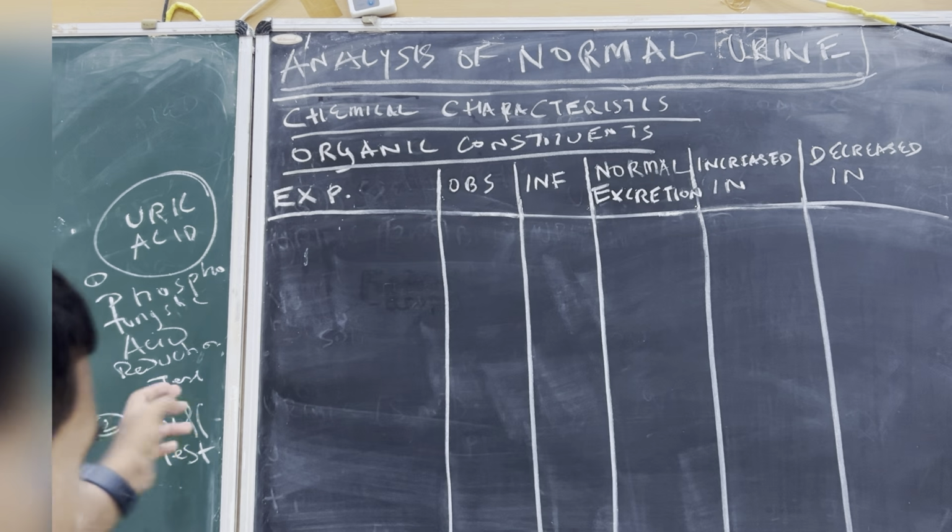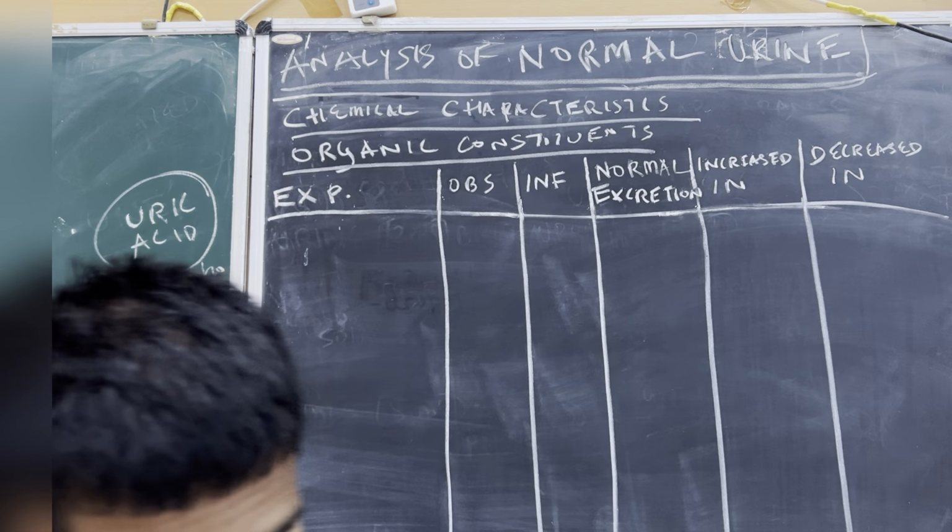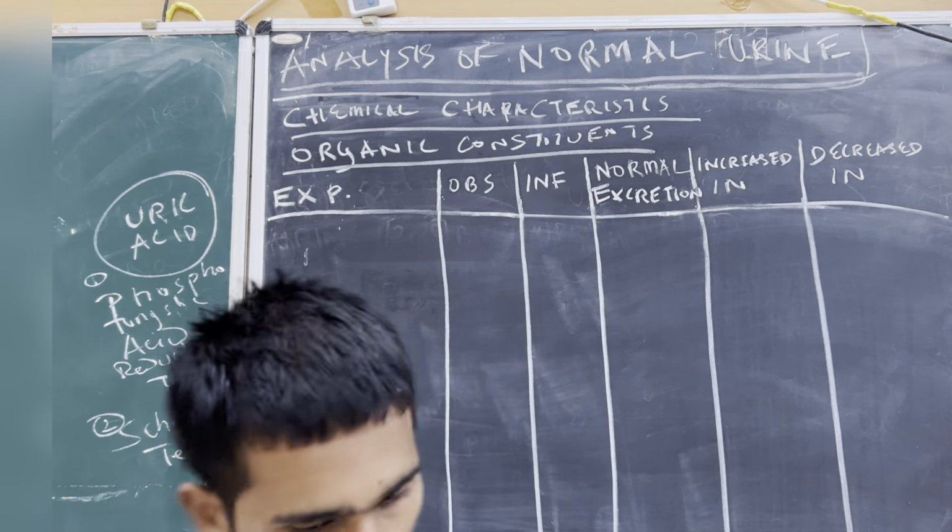So we start with the procedures. Phosphotungstic acid reduction test, what are we doing?